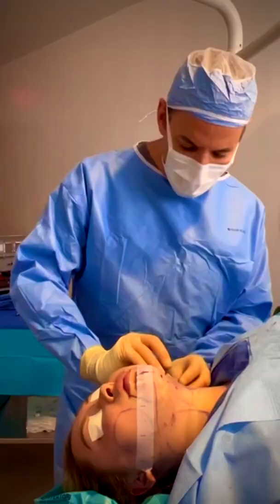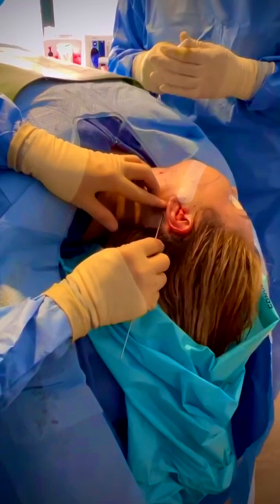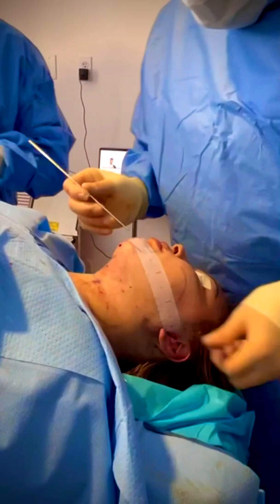This helps us build a corset underneath the skin that's going to support and shape her jawline. We take this little rod and flip it — Edward's putting the light on — and we go up behind the other ear, right to that little anchor point behind the ear. We pull all the thread through and Edward puts a nice little clamp on the end of it. Now we do what's called encircling and engaging the ligaments — we turn this little rod and go around the ligaments, and that's how we anchor it. We put the light back on so that we can safely pass it underneath the skin. That yellow light ensures we're right in the fatty layer and not too deep.